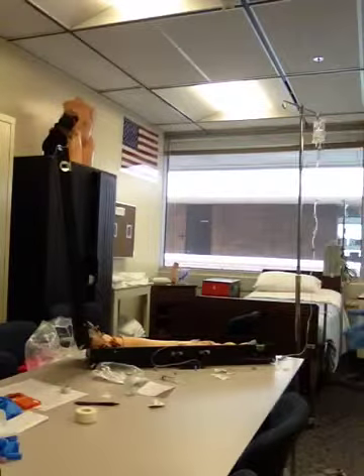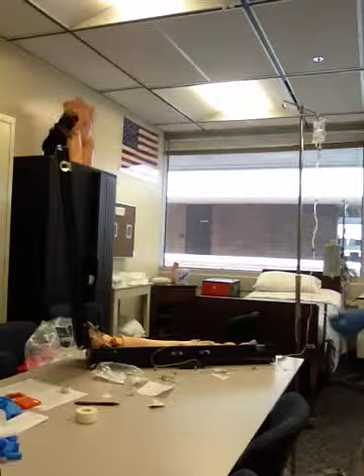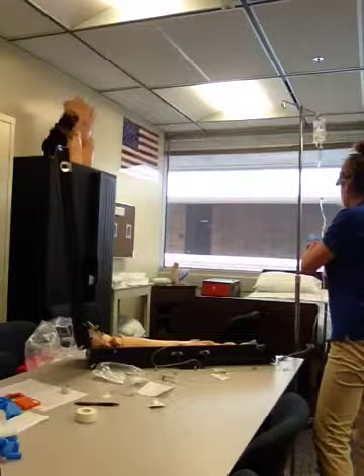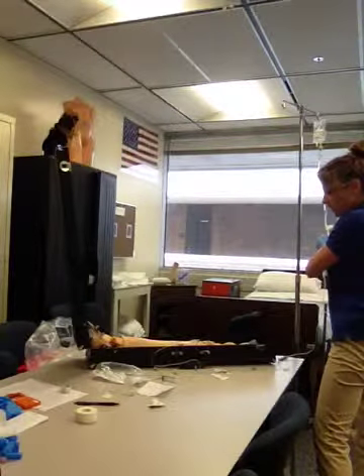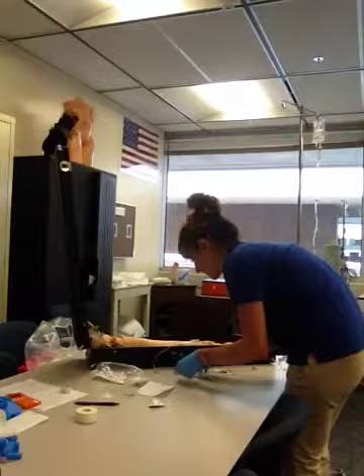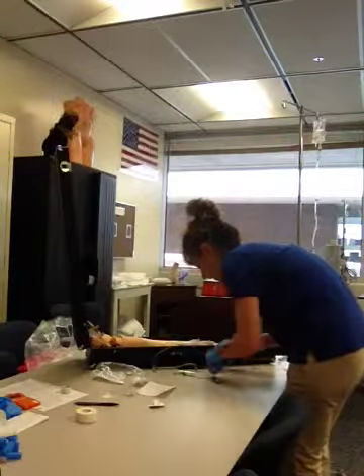So I'm going to pretend that I'm going to come back in. Knock, knock, hi, Ms. White, how are you? I see it's been 30 minutes, and I'll say that the bag is done already, and she's received her Herceptin. So I'm going to clamp off the Herceptin. I'm going to have my saline ready to flush the IV.